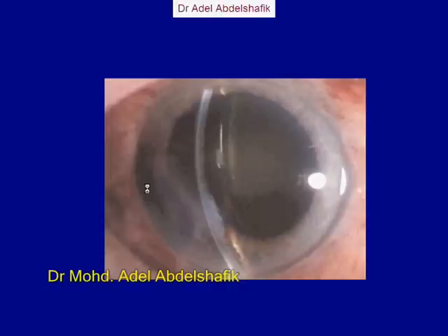So if you are in the outpatient clinic and you don't have fluorescein and you want to tell if this is an ulcer or not, this part looks thin. Regularly we put a stain and see whether it is stained or not, but if you don't have fluorescein, you just make the section very narrow and see the reflection of the anterior surface between the tear film and epithelium, and another light, the Bowman's. If you see these two, then you have an intact epithelium. So when you make a section, you can tell if the tissue is thicker or thinner.